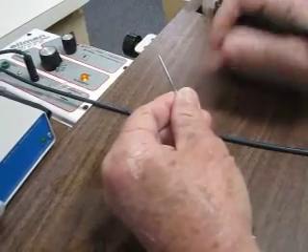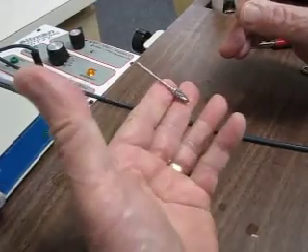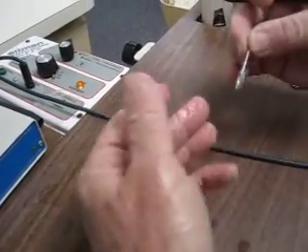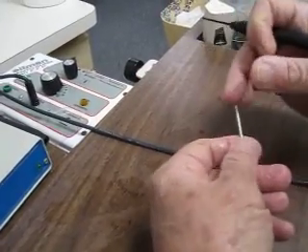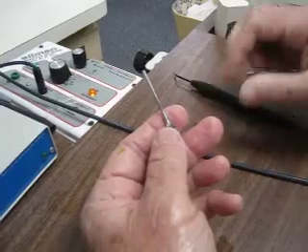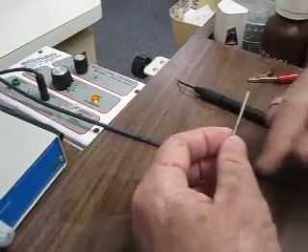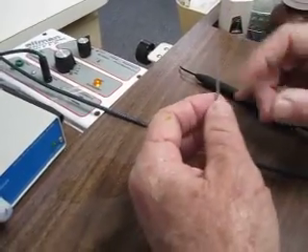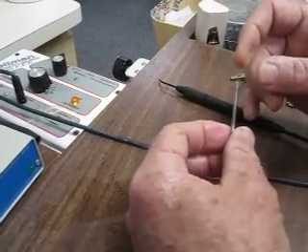I'm not holding on there very long. So this is really dangerous — my hand is really damaged and I have been burnt badly by the electrode and the electrode's heated up to... what a bunch of nonsense. Unipolar electrosurgery around implants is virtually impossible to do damage with. You can do damage by smoking the tissue around an implant, but that's different than touching the implant with the electrosurge unit.